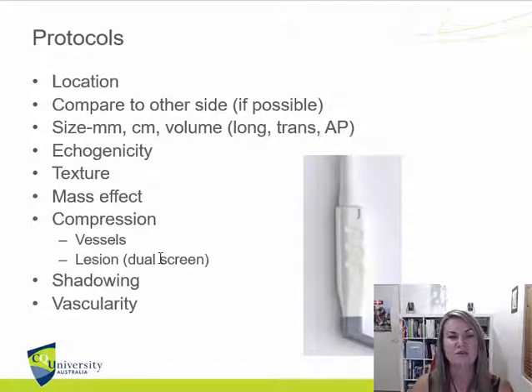Compression I've just talked about as well, so whether they're vessels, arteries or veins, that compression will come down into a vein. If it's a lesion, compression, just like the breast lesions we've done, is it going to be solid or is it fluid filled, using that dual screen with a compressed view and a non-compressed view.